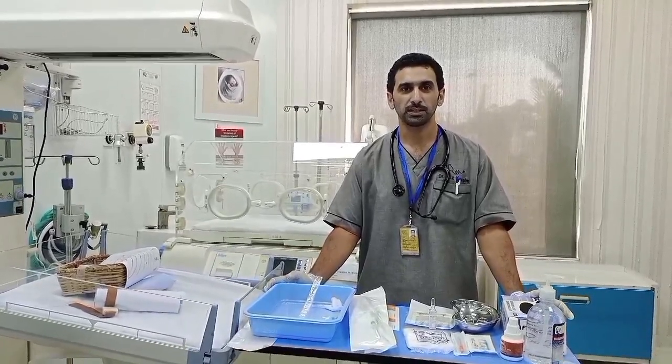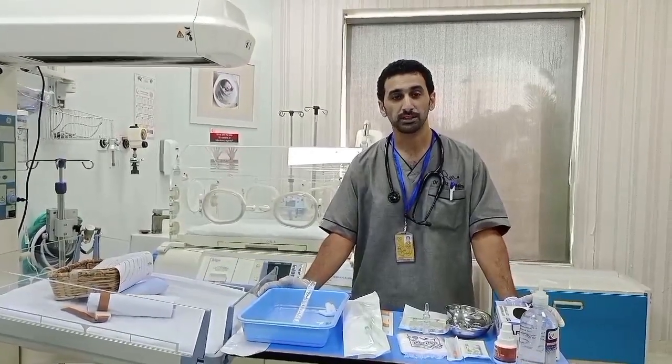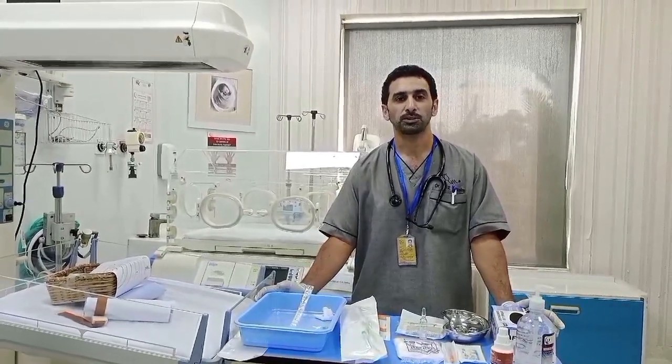I'm Dr. Faiz Assam, consultant pediatrician, and I'll be demonstrating how to insert the new generation chest tubes to drain the chest of air or effusions.